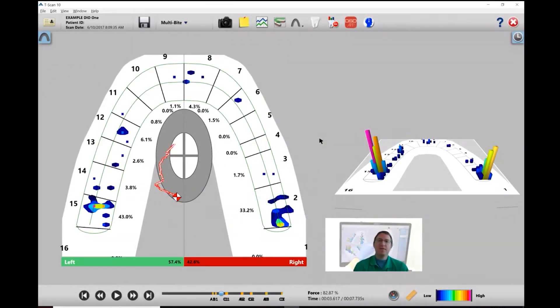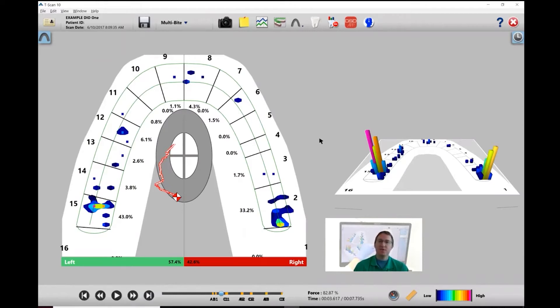Hey everyone, Shane here with TechScan. In this video, I want to show you how to set up your digital impression now that you've imported it into your patient.